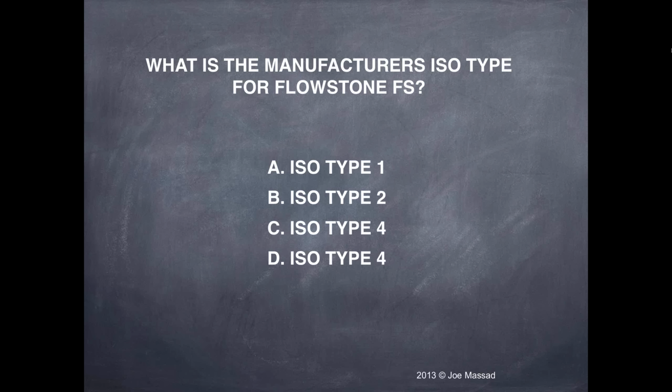Even the lab putty is expensive, and if you have undercuts, it's much harder to get out. So I like alginate. I think that works well, and it's very inexpensive.